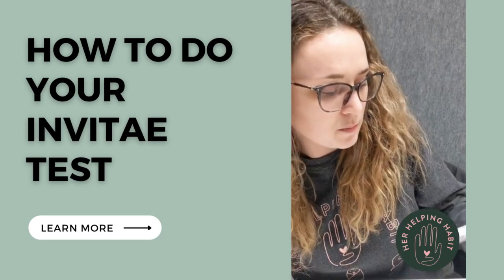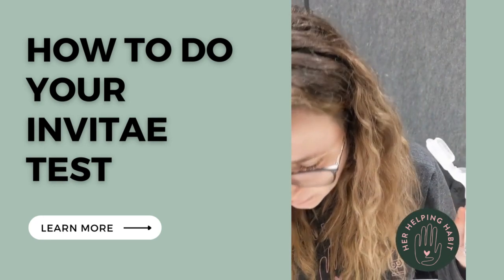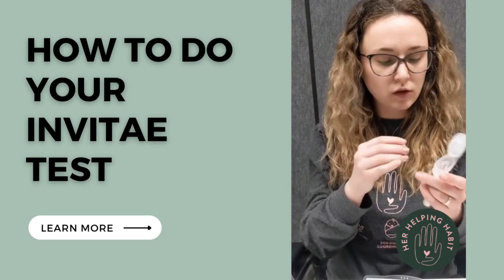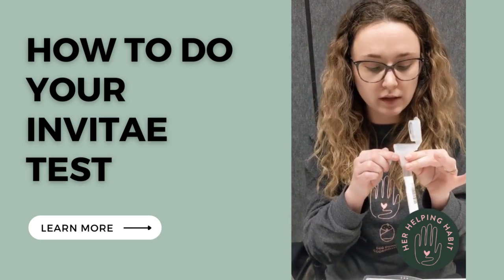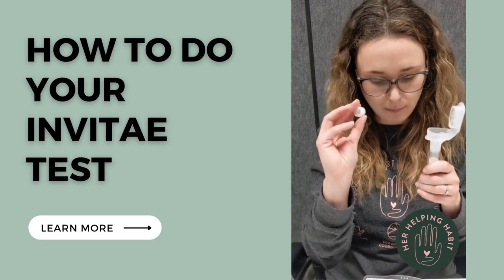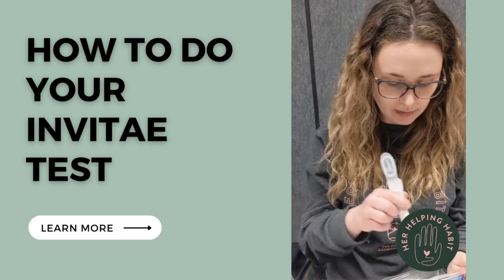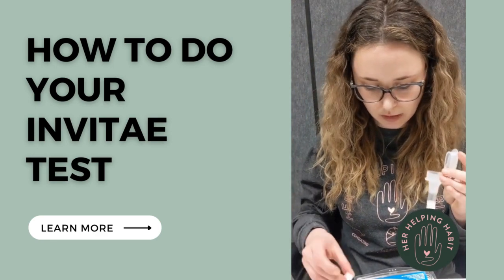You want to spit to fill to the line. Then you're going to close your cap and twist it off. In your little box you have another lid — this lid is already pre-packaged. You use the funnel to collect your saliva, spit in, take it off, and seal it with your final cap. You can discard the funnel piece after. Once that's done, put it back in here — and we're going to shake it for five seconds as well.